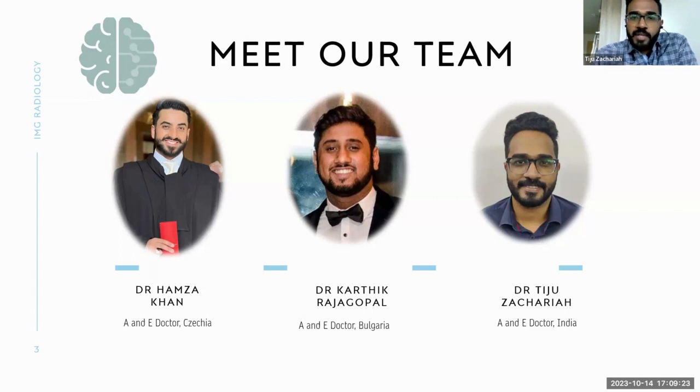So our aim today is obviously to help you take those first steps to understand the basic principles, learn how to approach reading any type of scans or radiological modalities, and basically understand how radiology influences every aspect of medicine at present. I'll give the mic back to Dr. Hamza to continue.